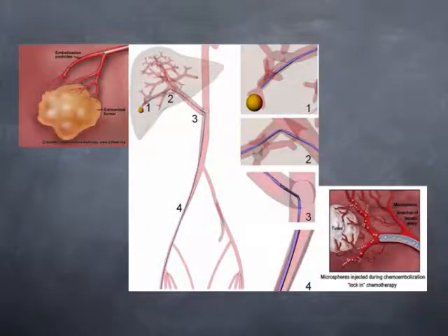And here are some of these particles that we would inject through these catheters to block up the blood vessels that go to the tumor.